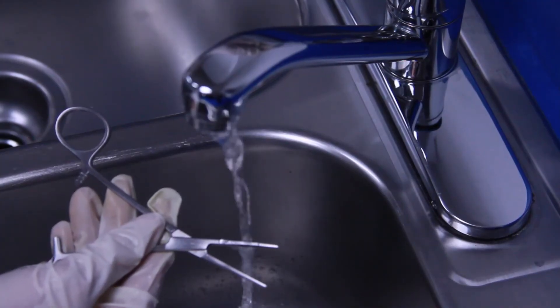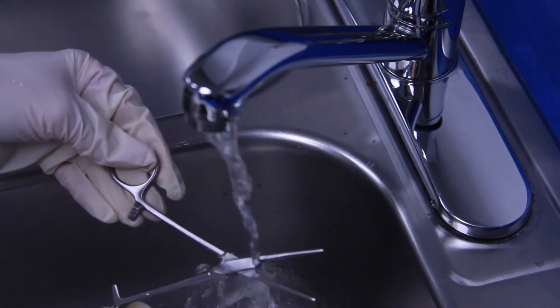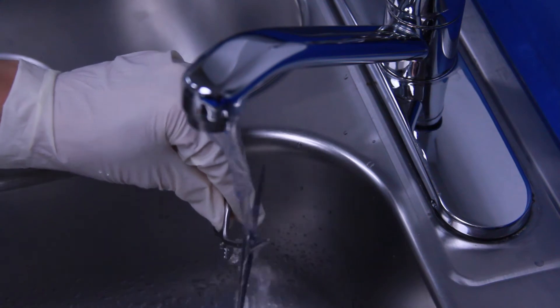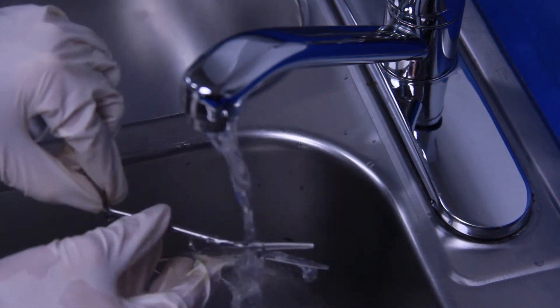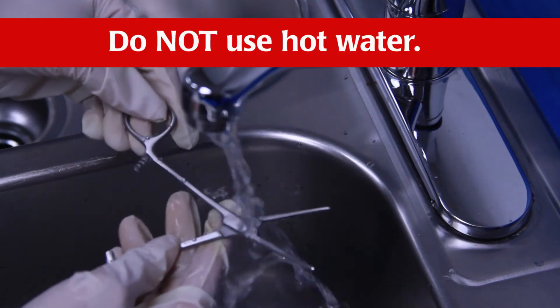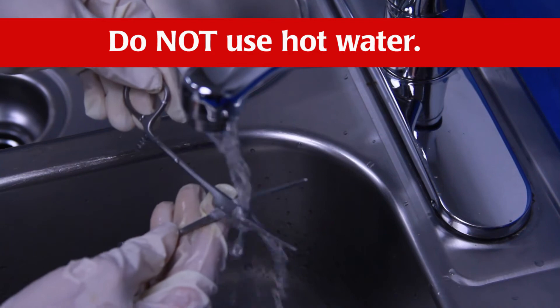Immediately after use, rinse instruments under warm or cool running water to remove all blood, body fluids, and tissue. Dried soils may damage the instrument surface and make cleaning difficult. Do not use hot water since this causes proteinous substances to coagulate.